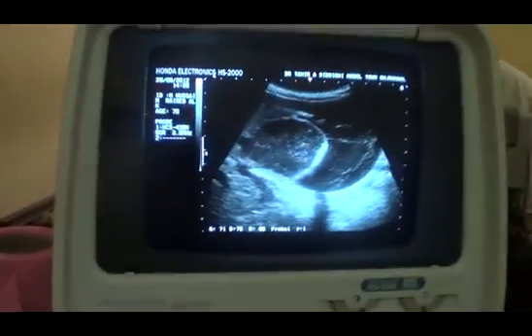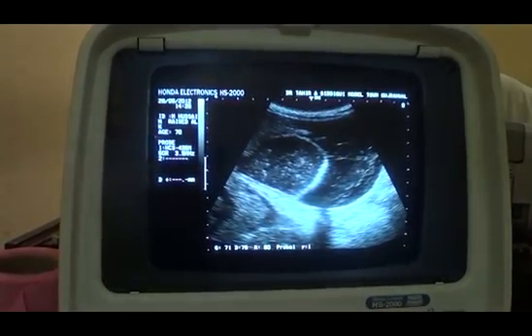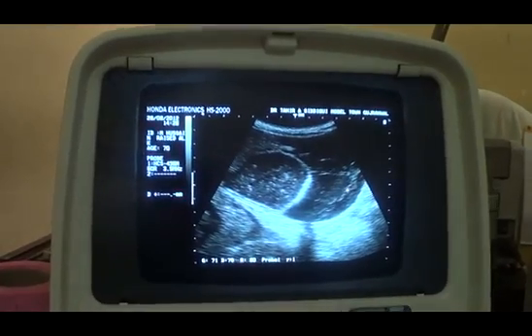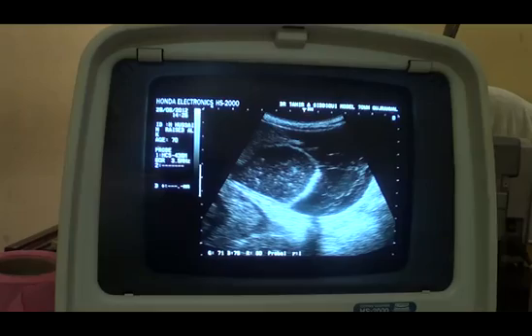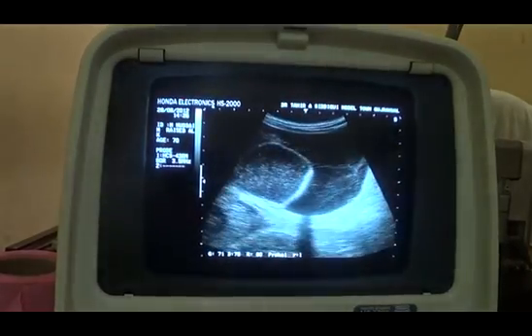And it is infective in nature. You can see that these are the debris. This bright area are all sand-like particles. Anterior portion is clear, thin septa. This is thin incomplete septa, thick septa. This is thick complete septa. So the look of this fluid pocket is that of it being infective in nature. Infective.